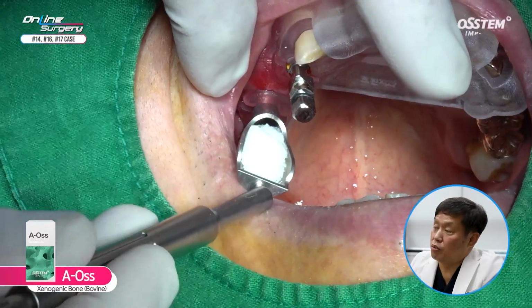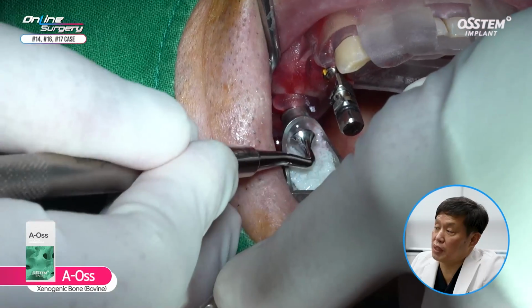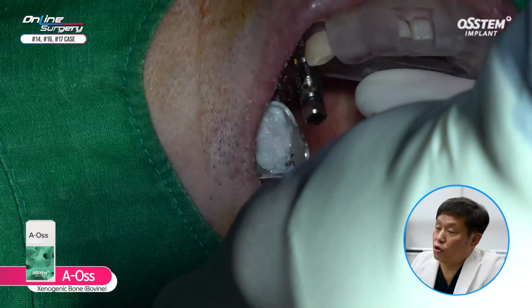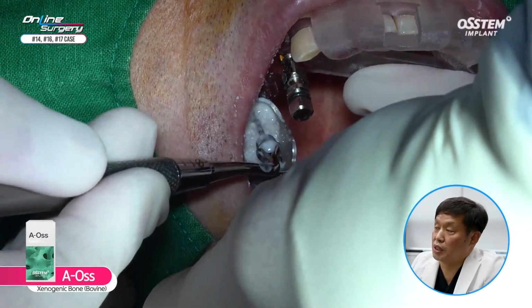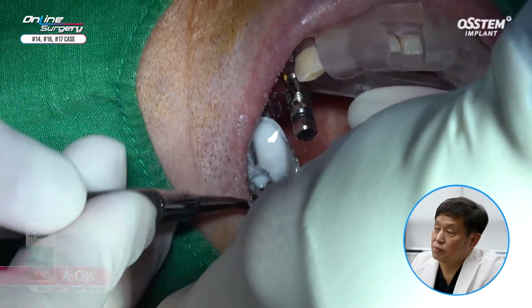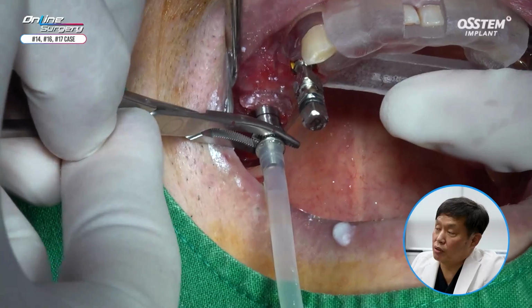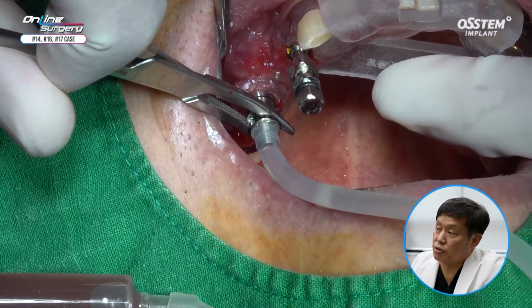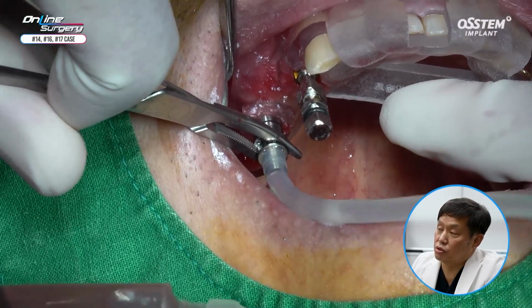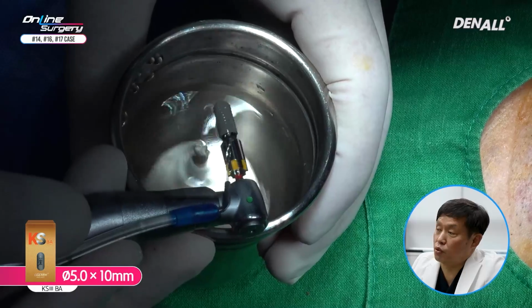AOS bone graft material was used with bone carrier. Bone grafting was performed in this way. If you do it gradually, you will not face any problem when performing similar technique. Aspiration was done to check negative pressure. There's a negative pressure and there's no damage to the membrane.